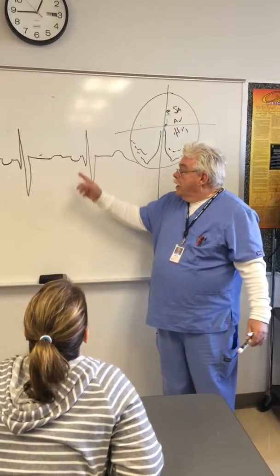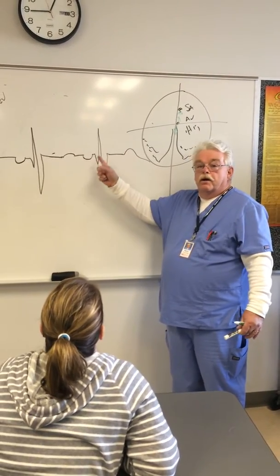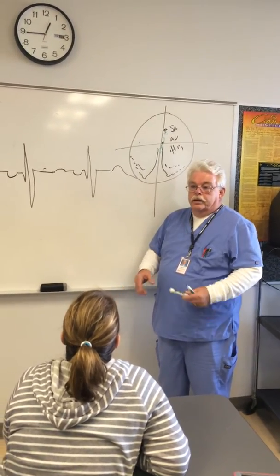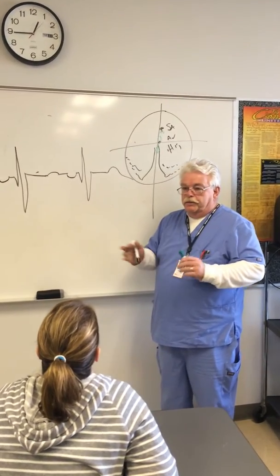It's a junctional rhythm. All I'm showing you here is you can have no P wave, a P wave over here, or an upside down P wave and still have a junctional rhythm. The one that's trailing is the retrograde, the other two are junctional. Don't worry about the fancy retrograde names. It's just me showing off.